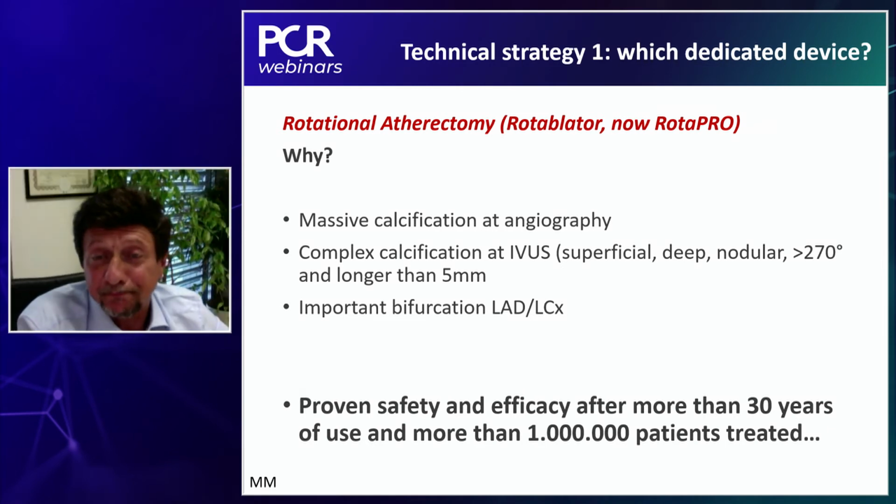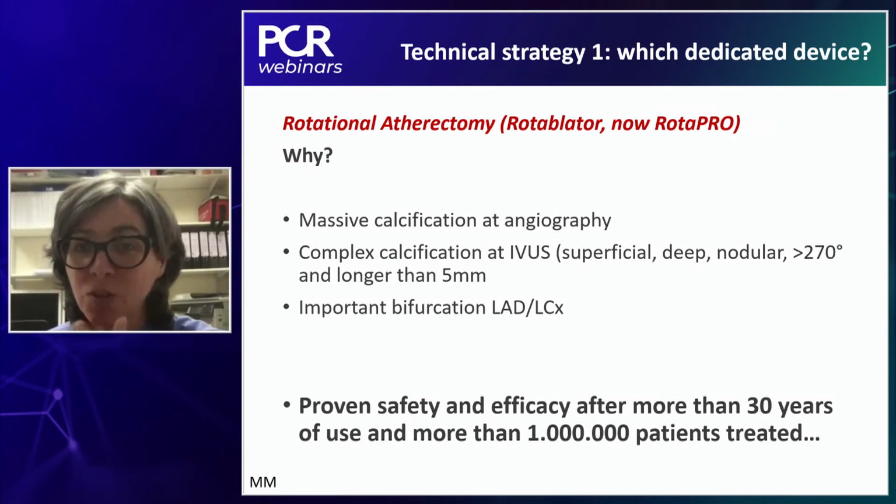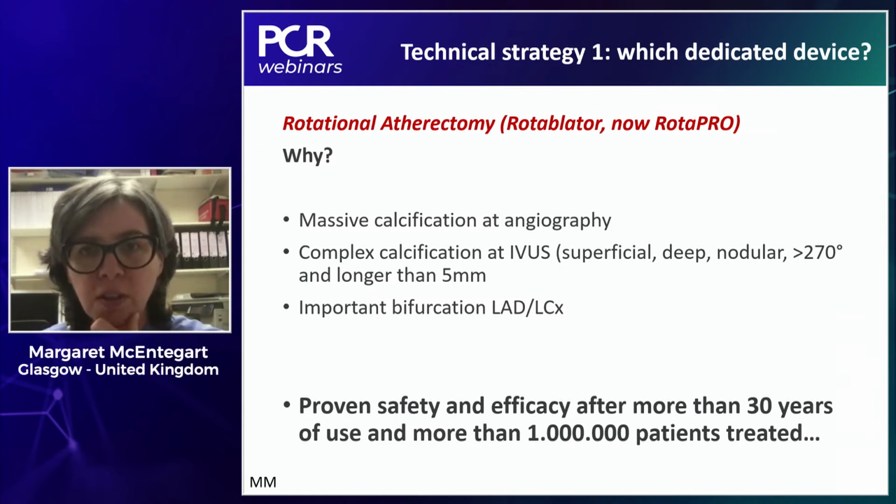Yeah. In addition, this is a good point. We also have to remember that this is a very proven, efficacious and safe approach to dealing with this type of disease. We've had rotablation available now for 30 years, and apparently it is now being used in over 1 million patients worldwide. And this obviously means a lot in a very evidence-based specialty like interventional cardiology.